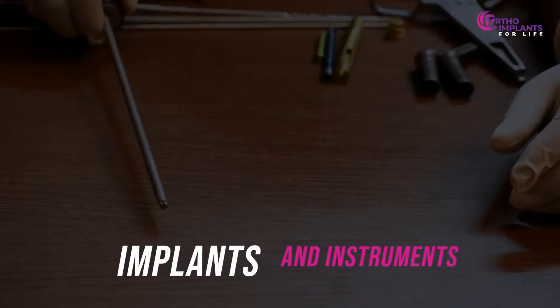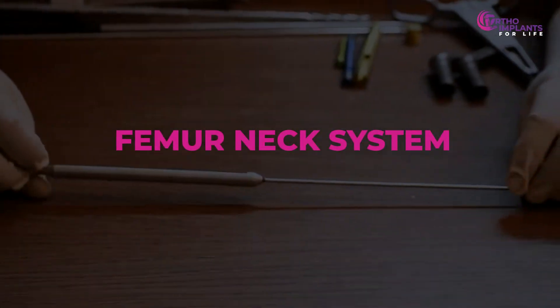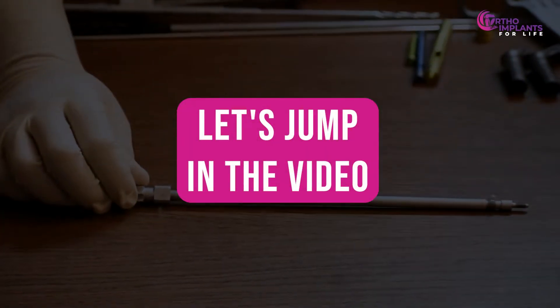Today we will show you the implants and instruments required for FNS, that is the femur neck system. So let's jump in the video.